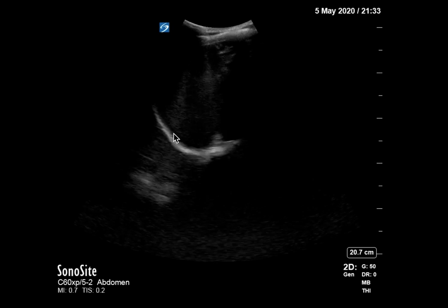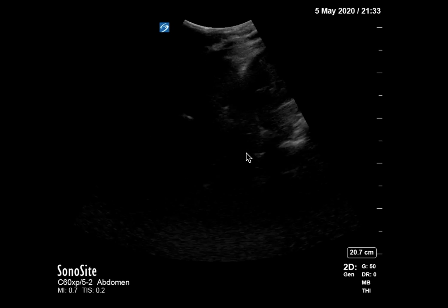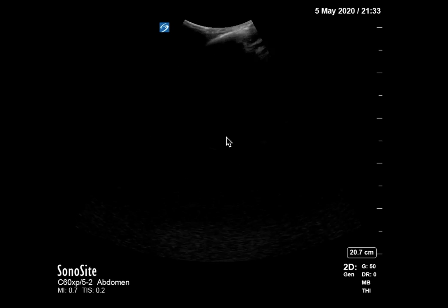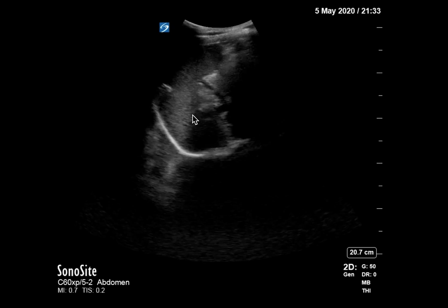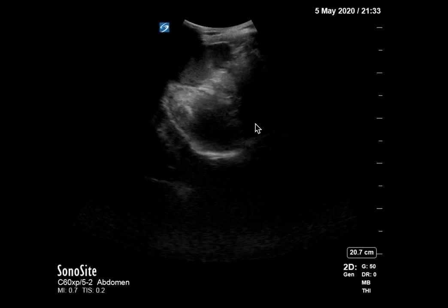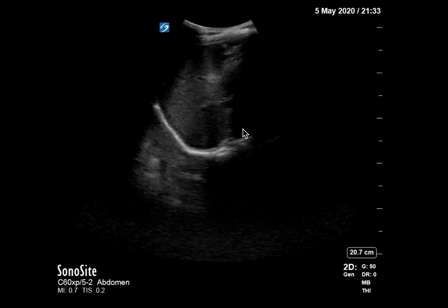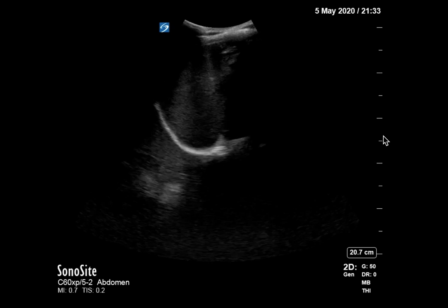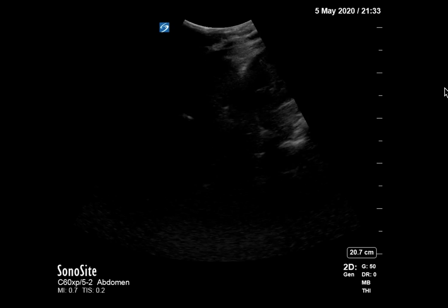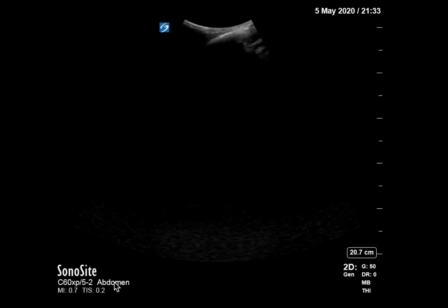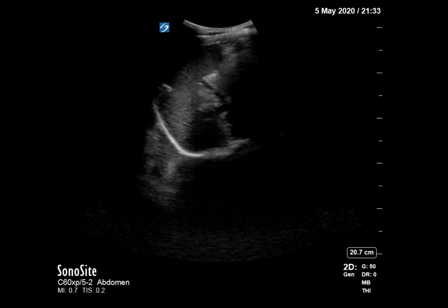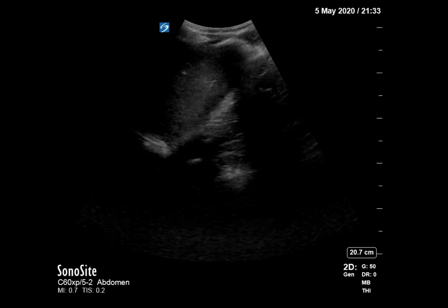We can see here in the left upper quadrant the diaphragm, the spleen right here, and the kidney. You can see this patient is a little tachypneic, but we can tell that there is no free fluid visible in that quadrant.